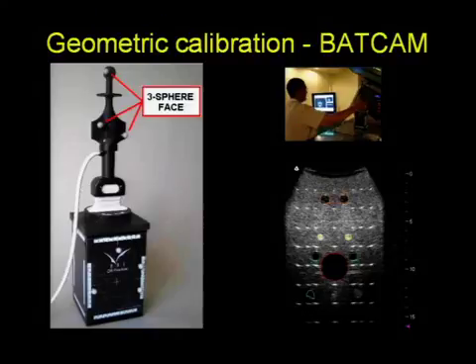So this is a picture of the Nomos phantom, which is used, displaying in this case the probe with the 3 infrared markers that can be used to correlate the position of the probe within the room, and resulting images showing the ultrasound of the day, with superposed on top of it the contours obtained from the reference CT dataset.